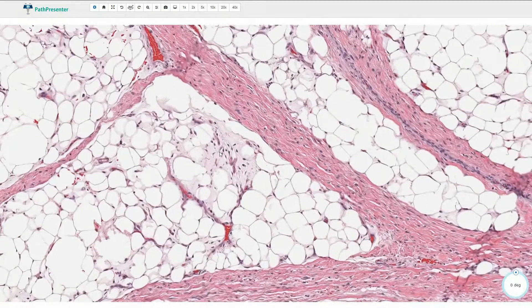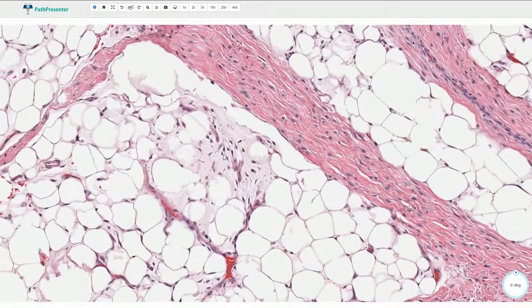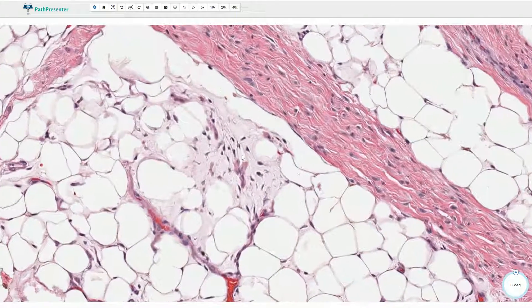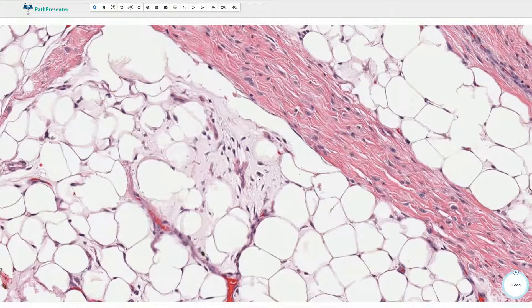Here we have the myxoid area composed of stellate-shaped or myxoid cells. In the background there is this slightly basophilic ground substance made out of hyaluronic acid or something similar.